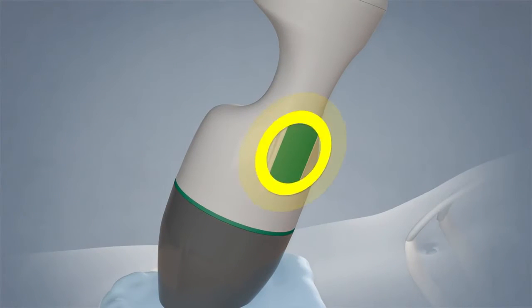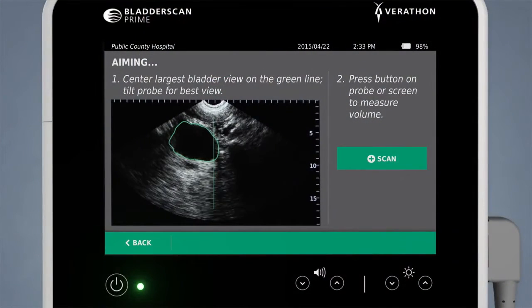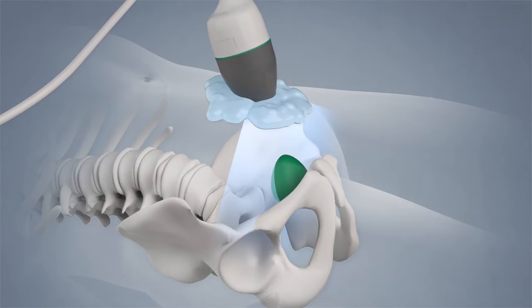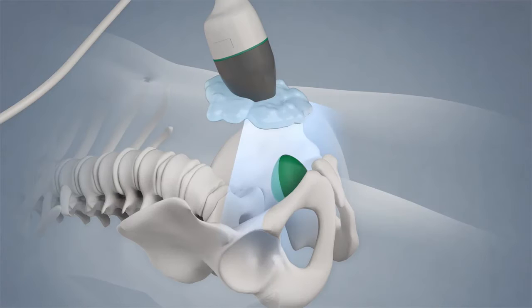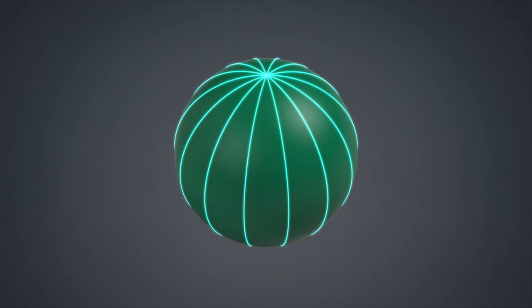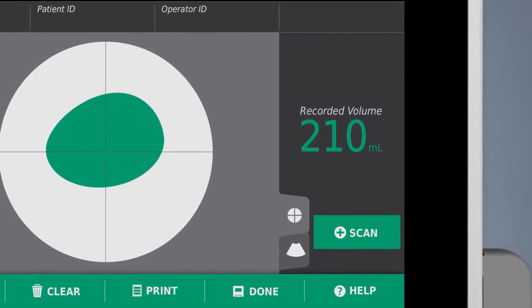Press the scan button to initialize BladderScan Prime's advanced high-resolution live B-Mode aiming. The aim is off-target if the bladder is not centered in the display. Re-aim the probe until the bladder is centered and the cross-section area is maximized. Press and release the scan button again to measure bladder volume. With patented neural harmonics and V-Mode technology, BladderScan Prime scans through multiple planes using two harmonics to produce a remarkable three-dimensional quantification of the bladder. Once the scan is complete, the screen displays the volume result.